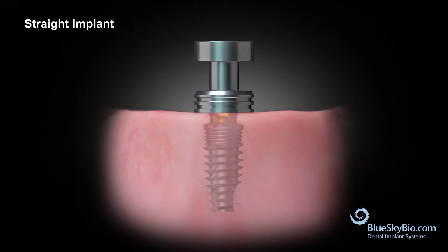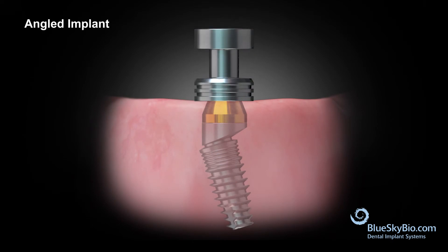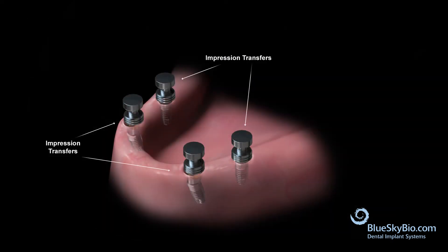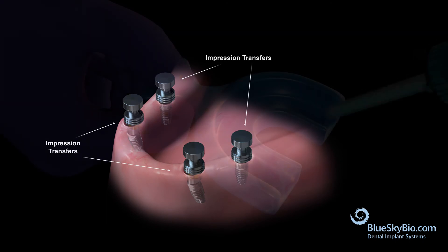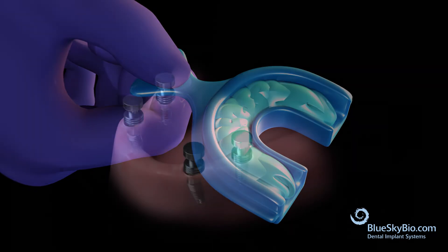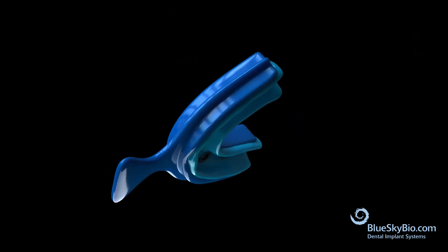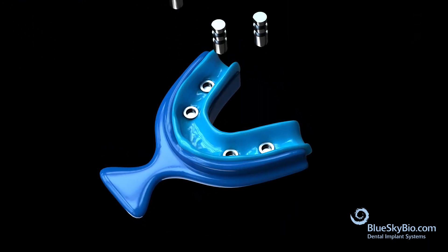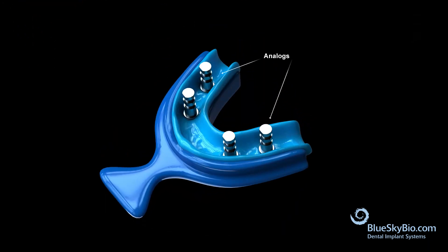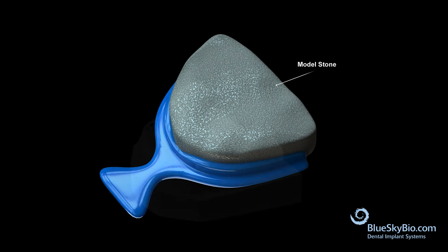Snap impression transfers onto the straight and angled abutments. Load the impression tray with impression material and place onto the lower arch. Remove the impression from the mouth and place analogs onto the impression transfers. Pour stone into the impression tray to build the stone model.